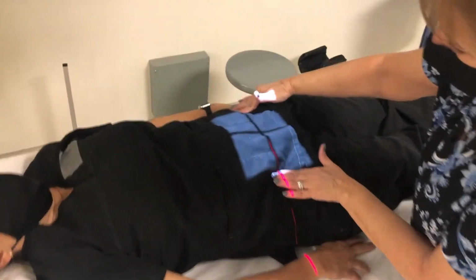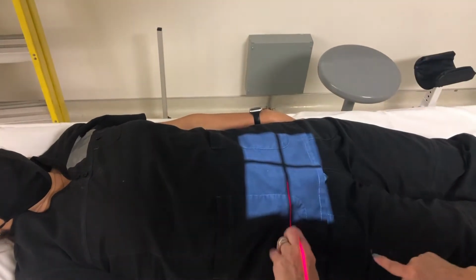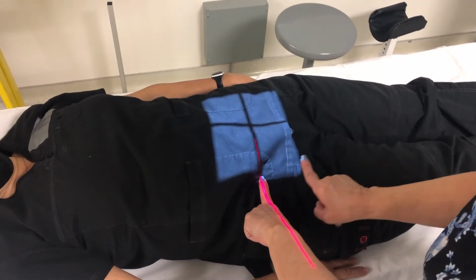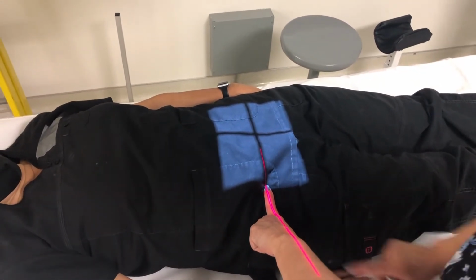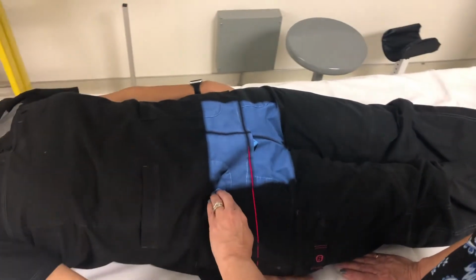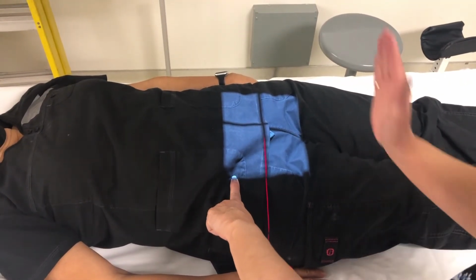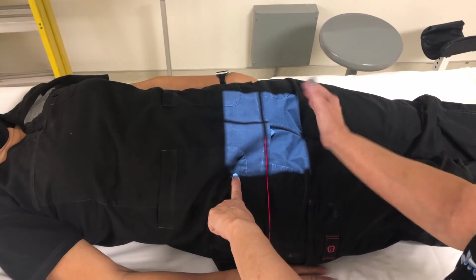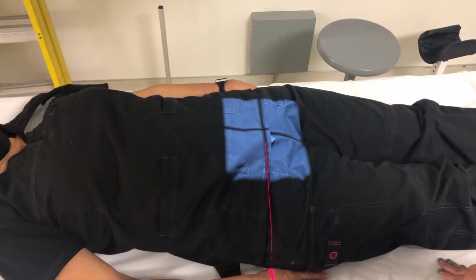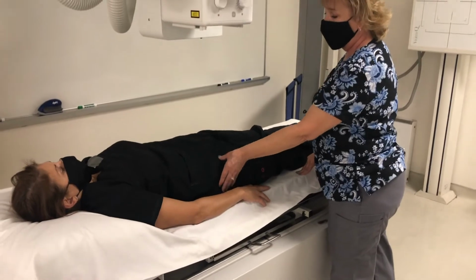For her ASIS, I know that about 2 inches down from her ASIS is mid-bladder, 2 inches up from her symphysis pubis. So I'm not going to palpate her symphysis. What I'm going to do is palpate ASIS and center about 2 inches below. Now I know that I've got the symphysis in there and her bladder should be centered right in the middle. So if you miss the bladder and you have to do a bladder shot, that's how you center for that.